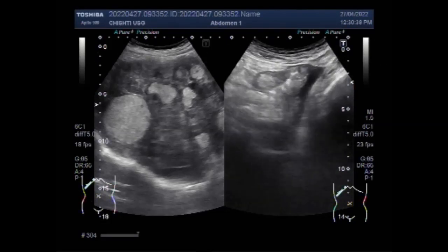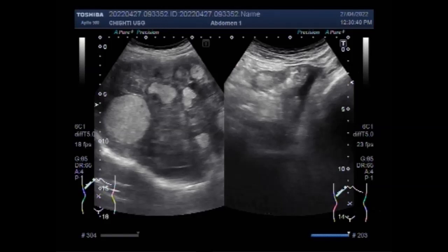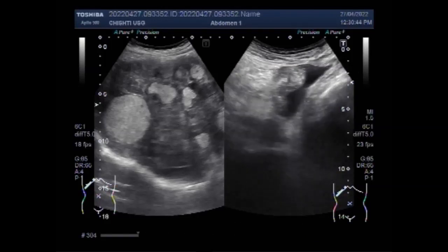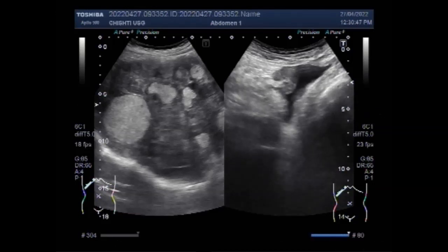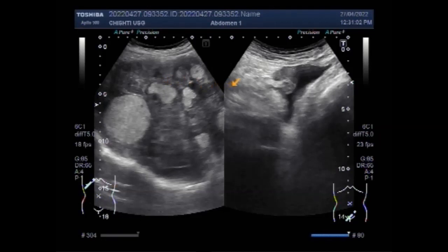Accurate characterization of liver masses by cross-sectional imaging is important in liver disease with cirrhosis, portal hypertension, and hypersplenism. Focal fat is also hyperechoic to the normal liver parenchyma on ultrasound. As seen here, the spleen is also enlarged in this case. There is mild enlargement of the spleen with ascites, which suggests the presence of malignancy.